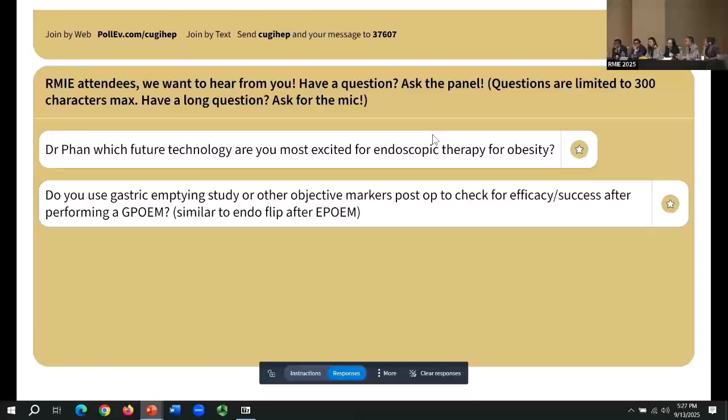So devices are always going to have their pros and cons, and you just have to be prepared for that. Yeah, I did highlight that there were 3 patients in that randomized controlled trial that went on to surgery after failed EUS-GE. And there were also fatalities reported secondary to maldeployment.